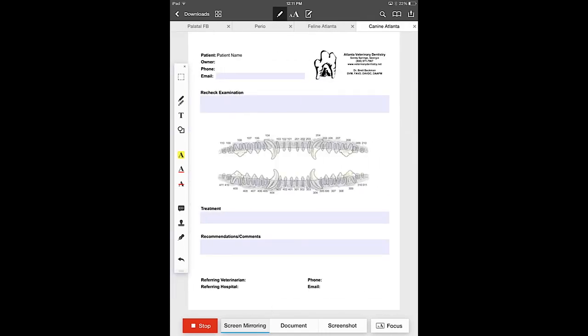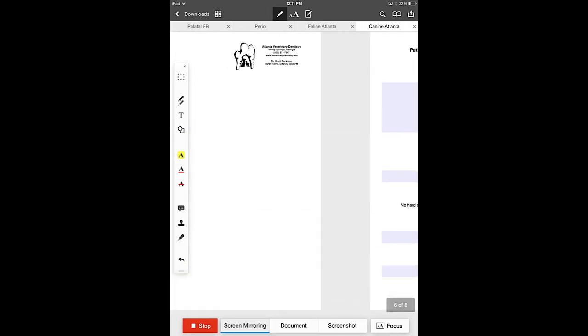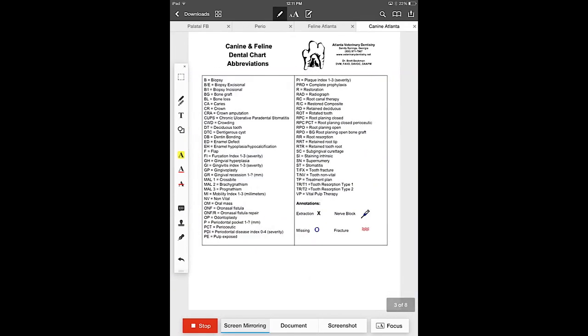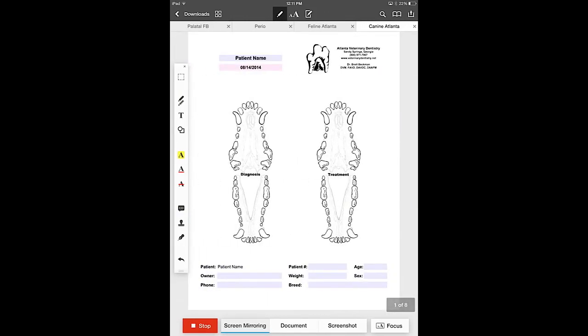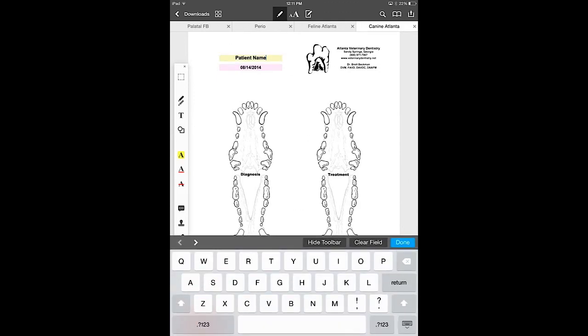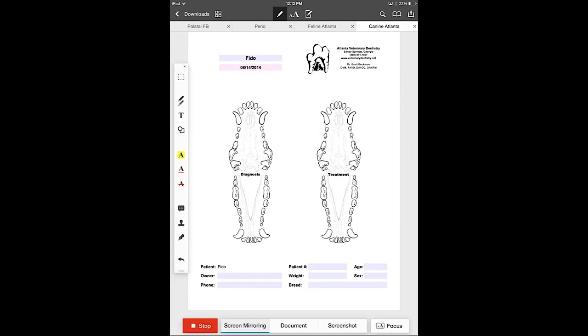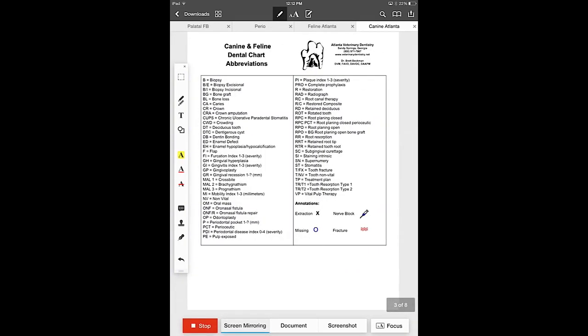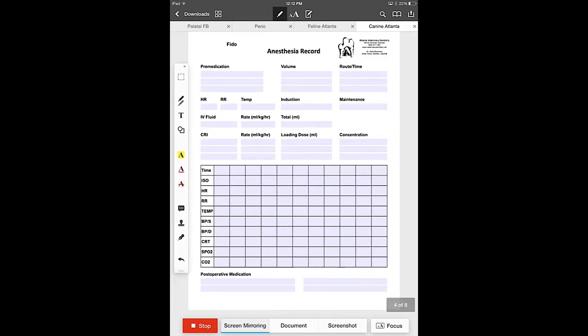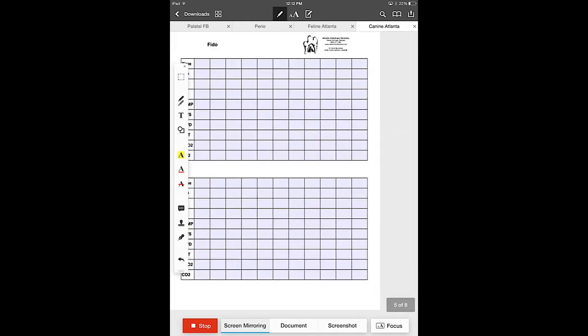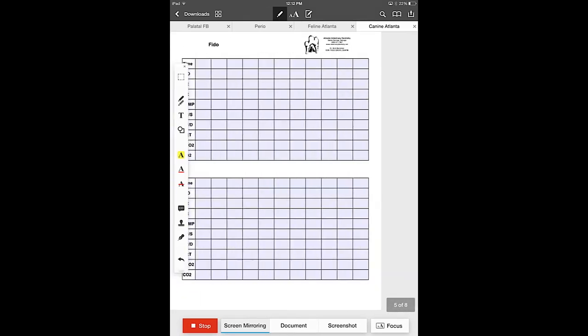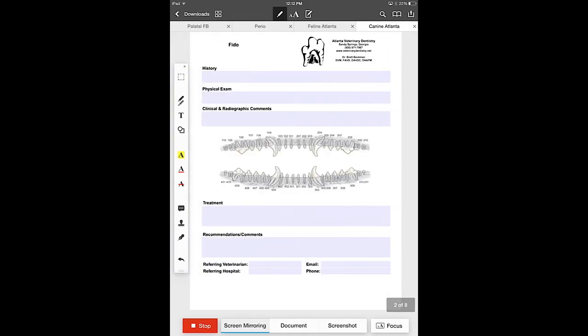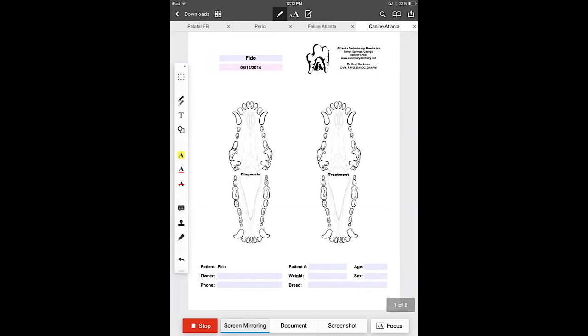Now if you notice there are highlighted areas in all of these pages with a few exceptions and those highlighted areas are where you can automatically fill information into those pages. For instance if we tap the patient name and we type in any patient name and hit done that will populate on the other pages as you see in the upper left corner of all those additional pages.